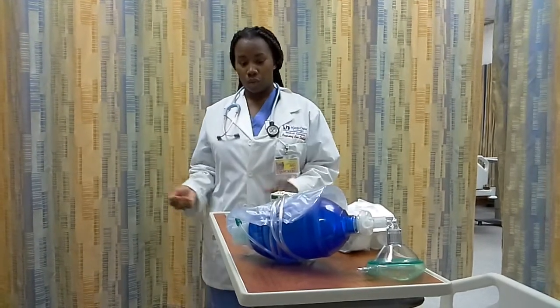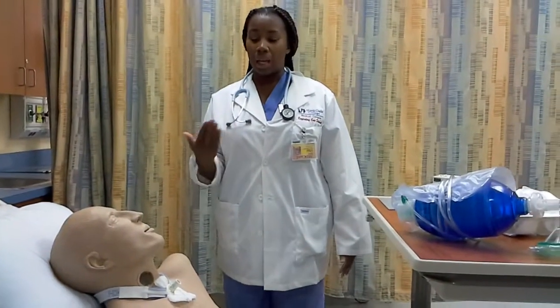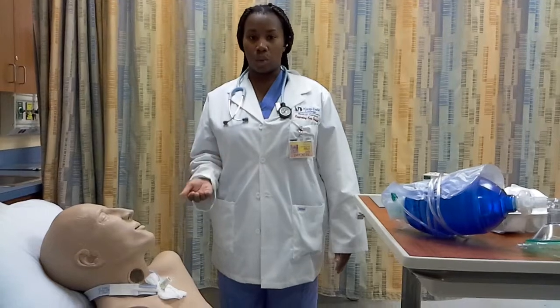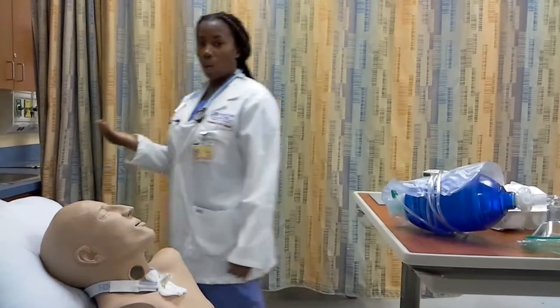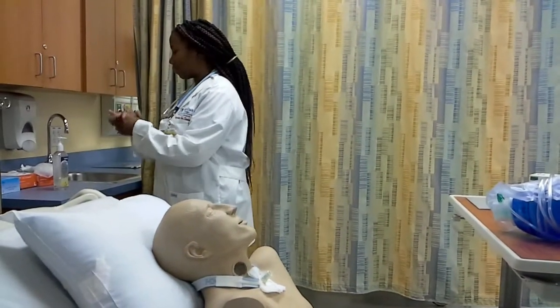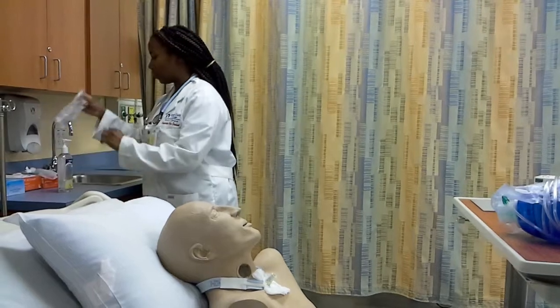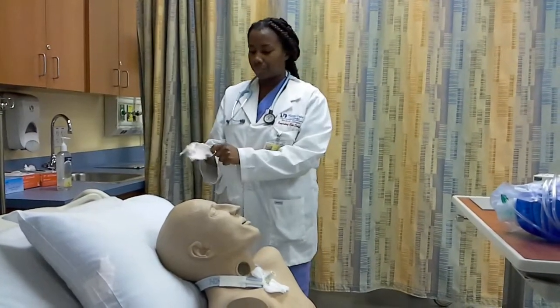I will go into the room. I will introduce myself to my patient and let them know what it is that I'm going to be doing. Now, what I'm going to do next is go ahead and wash my hands for 15 seconds. And then I'm going to don my PPE, which is my gloves and my gown.